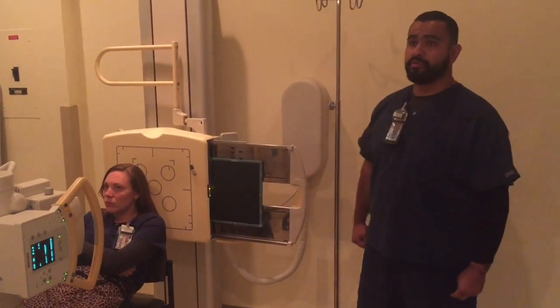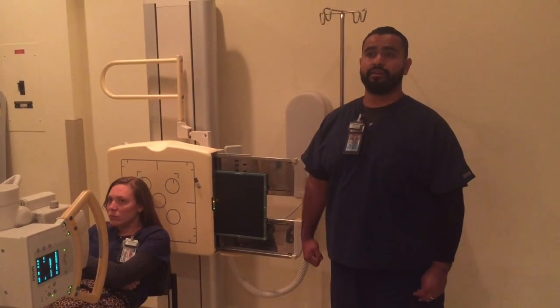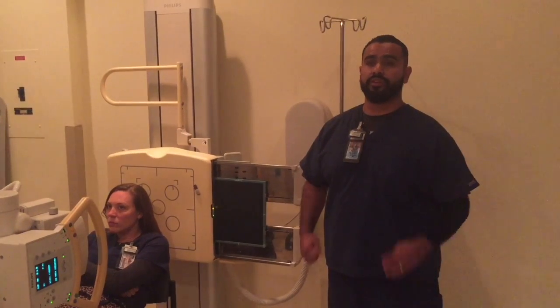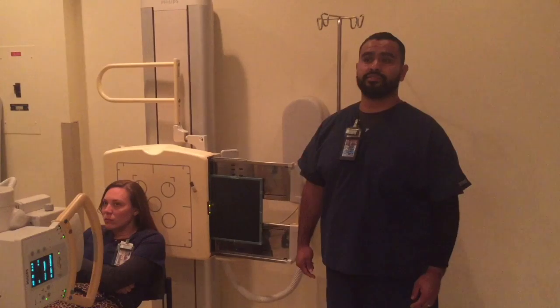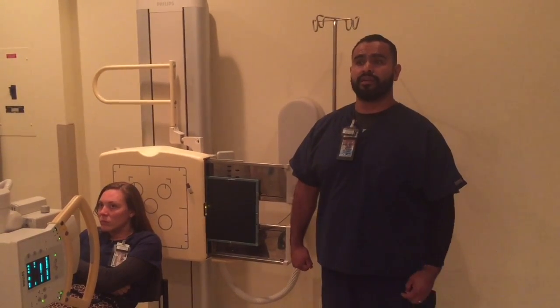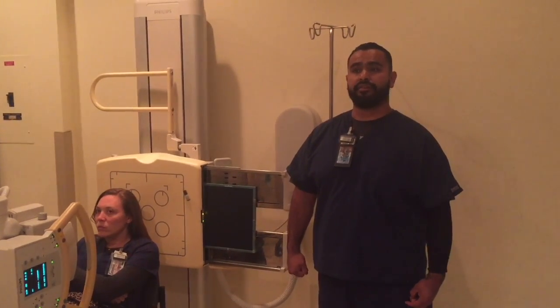And for this image, I will be making sure that the central ray is perpendicular to the IOML. It will be entering the mid-sagittal plane of the throat between the gonions and passes through a point about 3/4 inch anterior to the EAM. Also, the IOML will be parallel to the IR, and the mid-sagittal plane will be perpendicular to the IR.